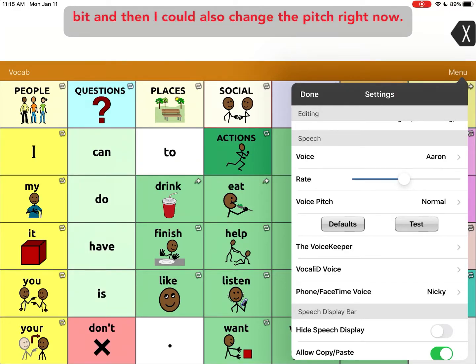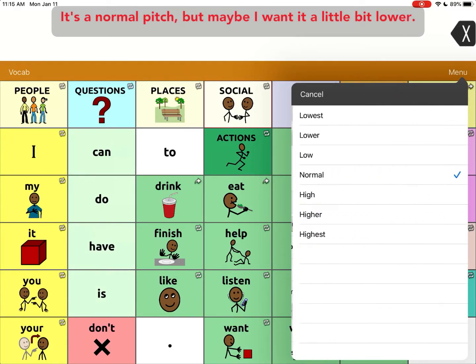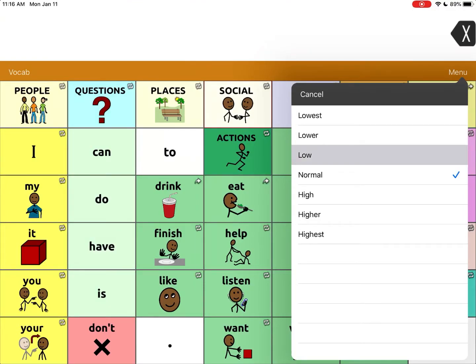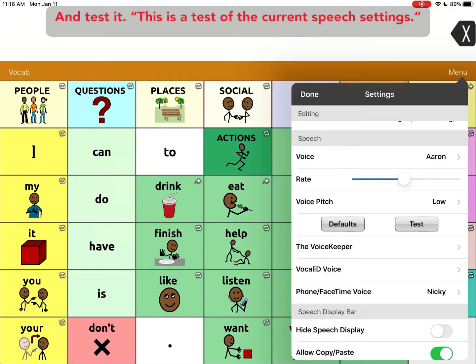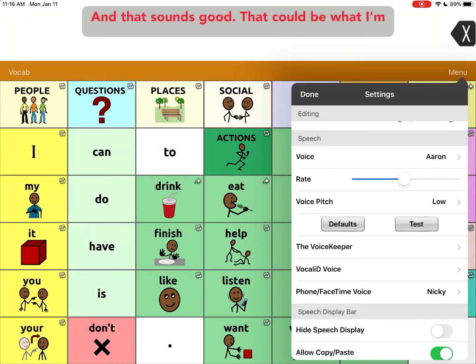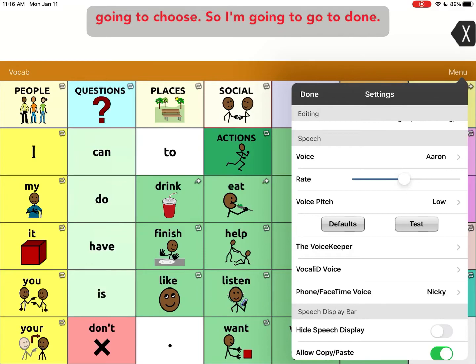I could also change the pitch — right now it's a normal pitch, but maybe I want it a little bit lower. Let's test it: 'This is a test of the current speech settings.' And that sounds good — that could be what I'm going to choose.